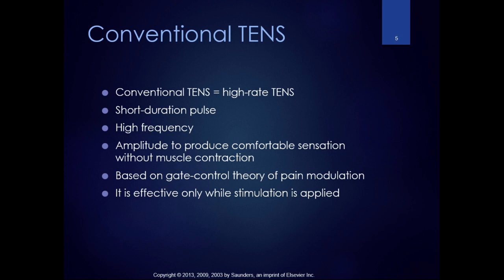What was happening was, it used to be that in order to get a TENS unit, you had to get a doctor's prescription. You had to go to PT. Different insurance companies had different requirements. They were very expensive. They were probably $500 to $800 for one of the units, or sometimes your insurance company would rent them from EMPI or other manufacturers.